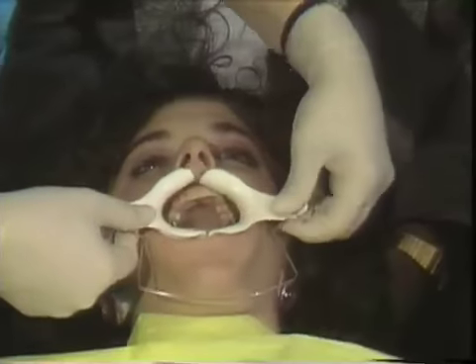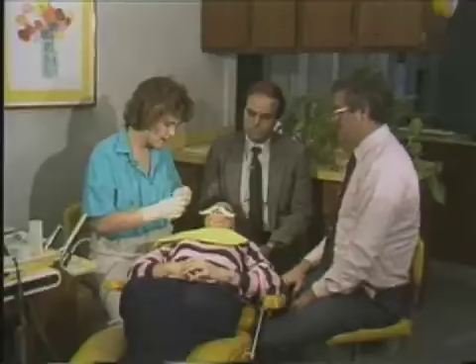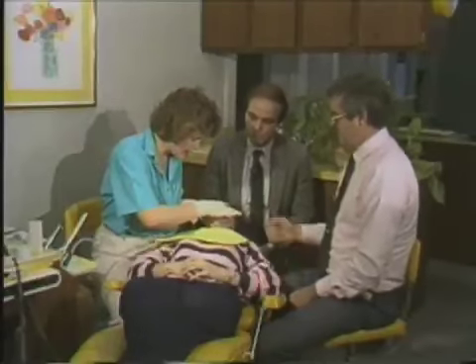Now, Amy, is that pinching anywhere? Mm-mm. Can you bite down a little bit more? There we go. And then open wide. I want to show that.